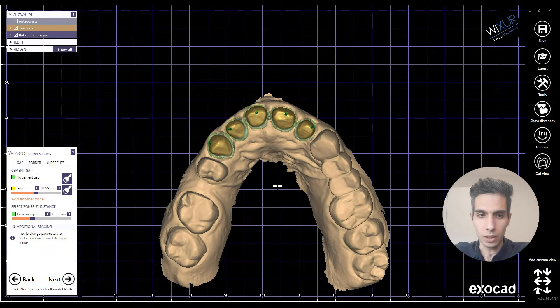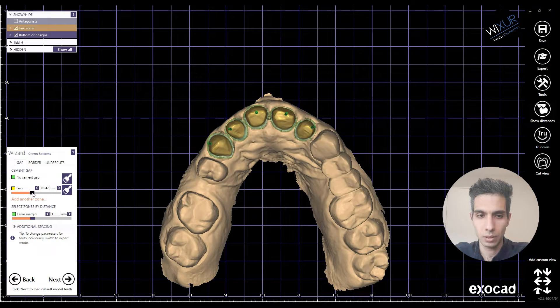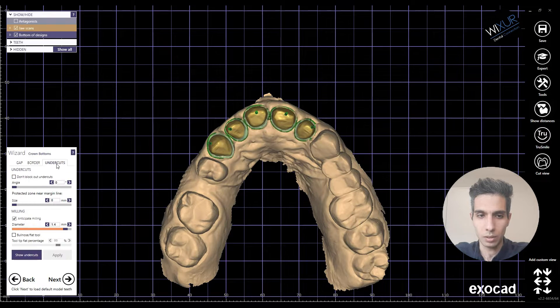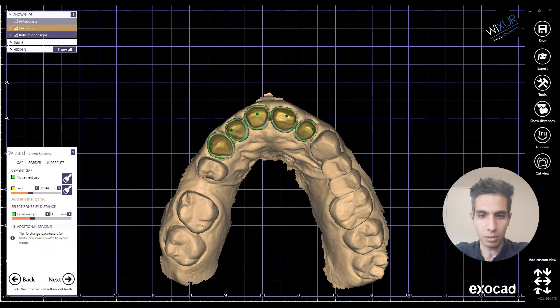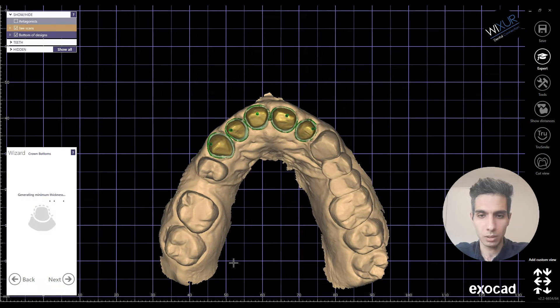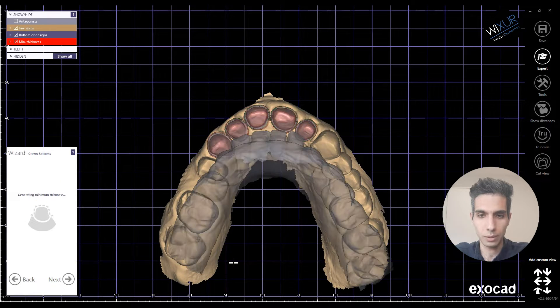Okay, here are the crown bottoms. I'm going to do some things about gap and undercuts. Looks good.